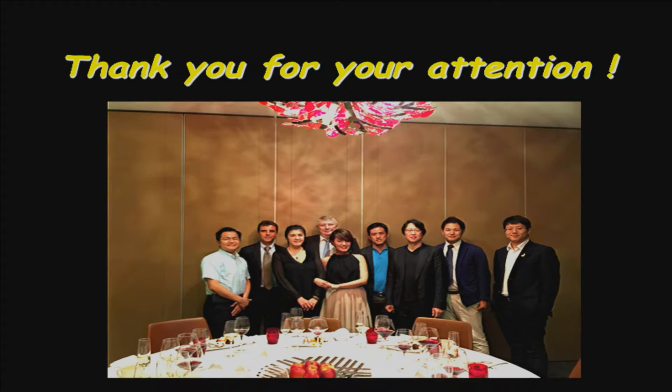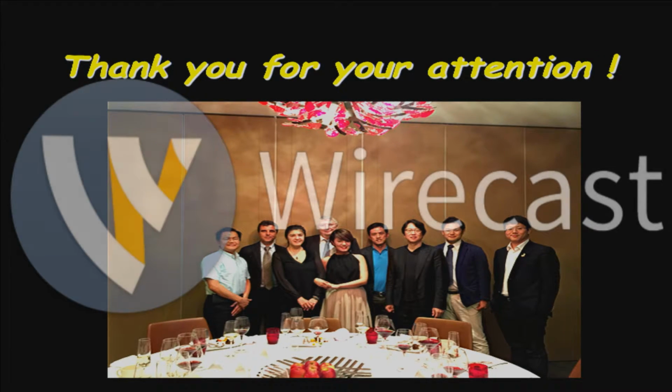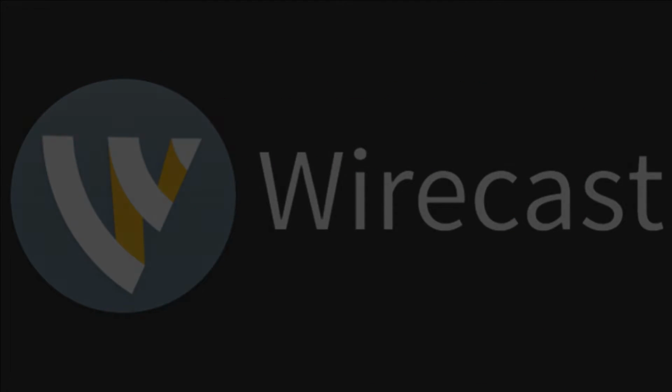High-risk patients should be careful. Tomorrow, if possible, I want to show the very dangerous cases. Okay. And I have another question about the solution that you inject. I saw in your slide you always use epinephrine, right?